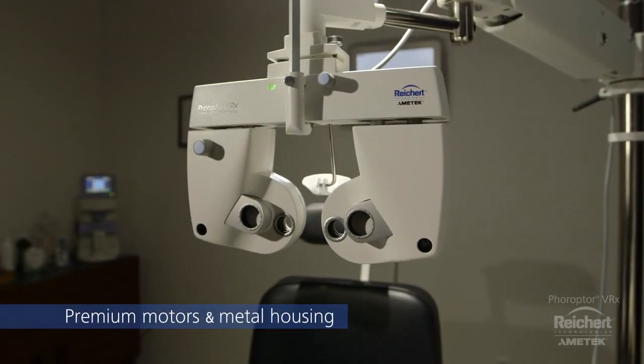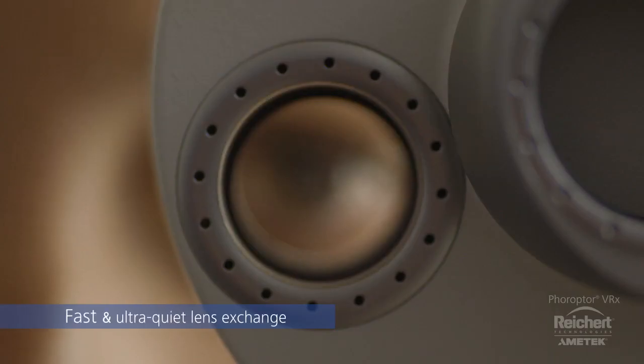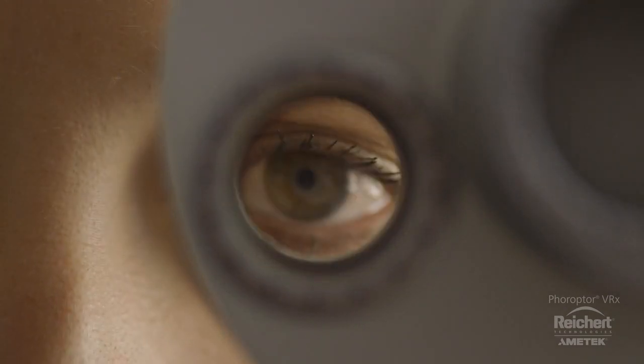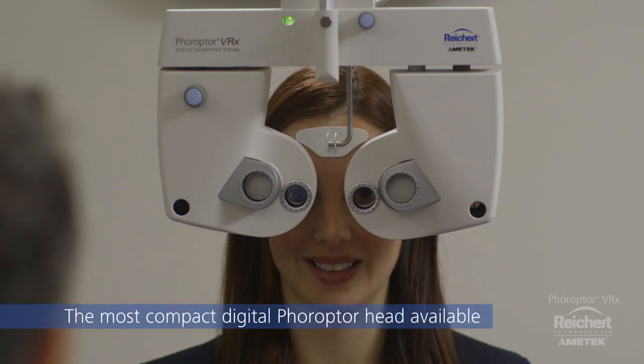Premium motors and metal housing provide Feropter VRX with incredibly fast and ultra-quiet lens exchange. Unlike other digital refractors, your patients will hardly notice the lens movement. With the most compact digital Feropter head available, Feropter VRX is non-intimidating and allows for greater patient visibility.